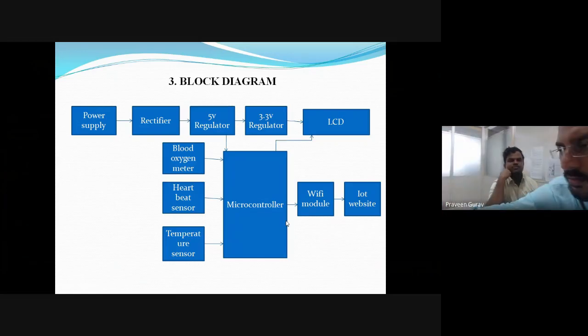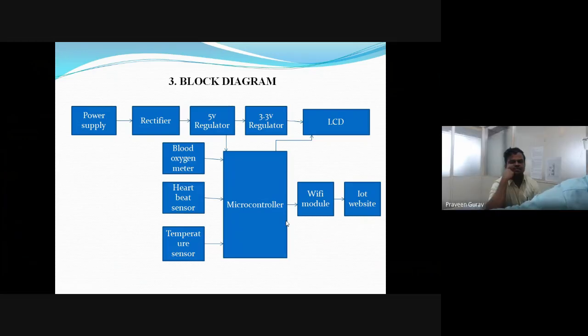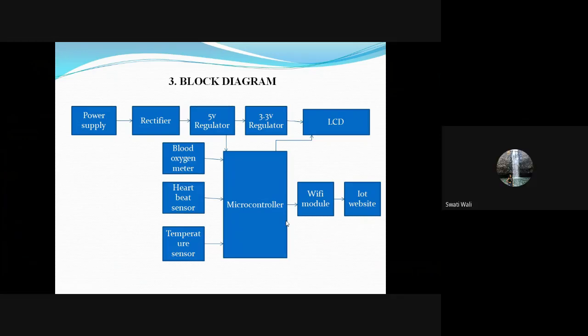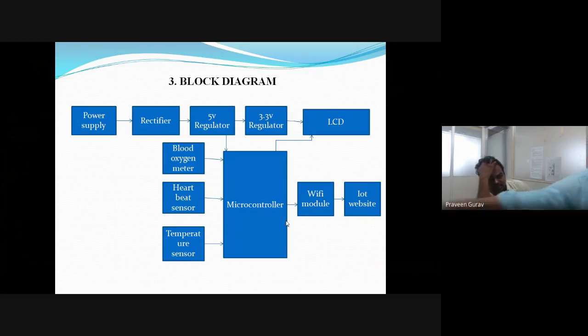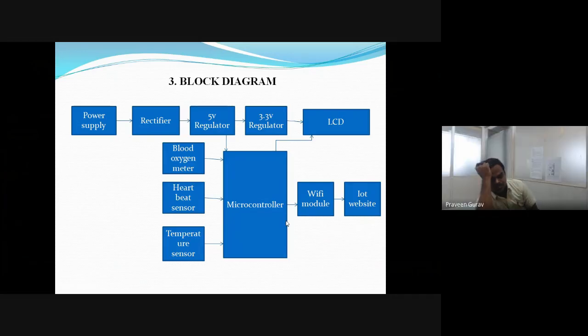Next question is the same question to Swati. What is the unit to measure the blood oxygen meter, and what could be the standard value of the blood oxygen meters?